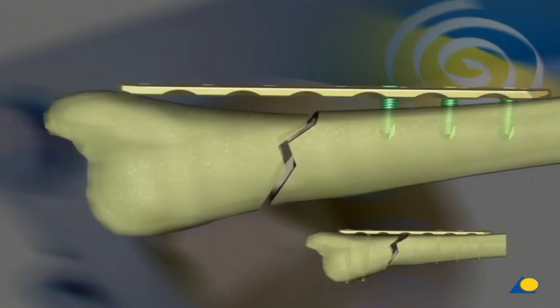The reduction is maintained by fixing the plate with locking head screws. Therefore, the plate does not have to be contoured precisely.